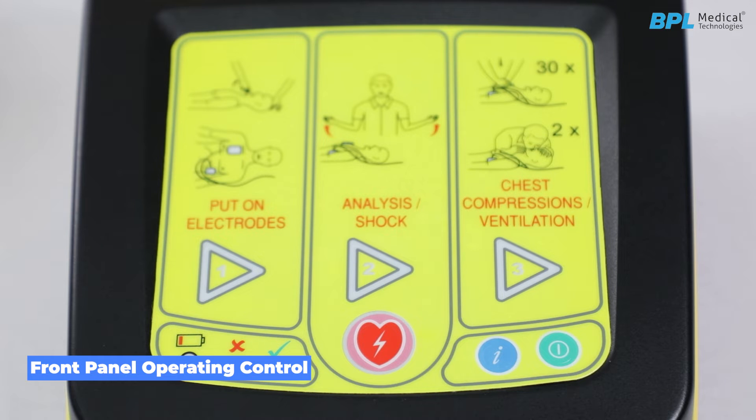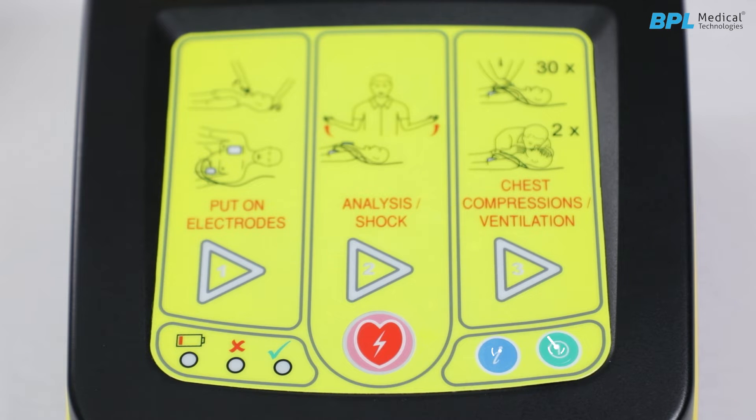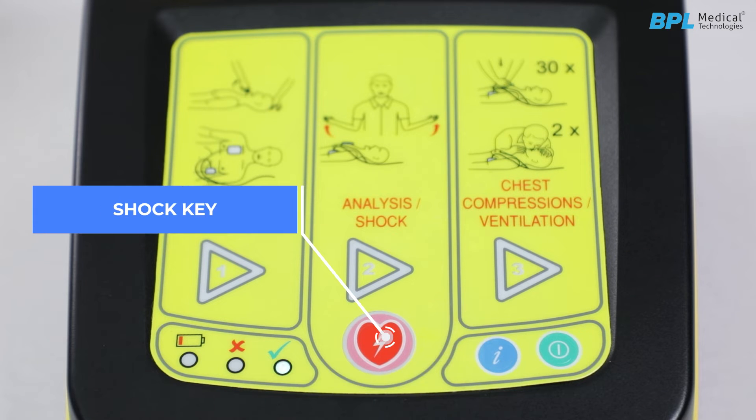Front panel operating controls. On/Off key to switch the defibrillator on or off. Info key provides information in audible form on the number of shocks that have been applied since the device has been in use. Shock key: pressing this key causes a shock to be delivered to the patient.